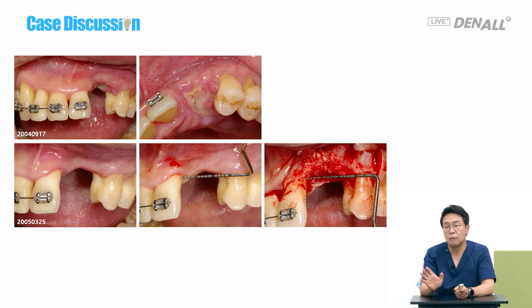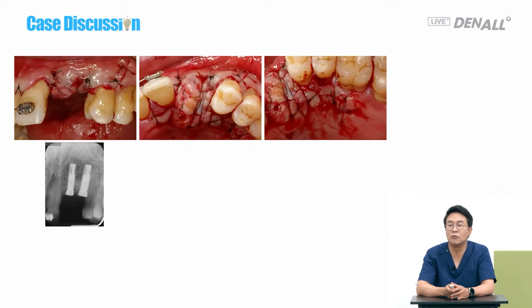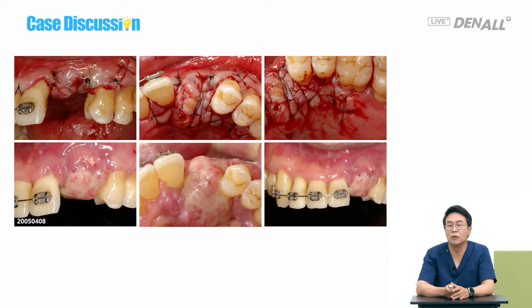And also at number 24, if you look at the situation here, the bone loss at adjacent teeth were quite serious. So there was a limitation to what we could do. So implants were placed, following the rule of 3 millimeter gap between them. The implants are not in a straight line. The buccal contour and height of bone was maintained and they are placed again. Fortunately, no exposure was made, so I gave instructions to the patient to follow.